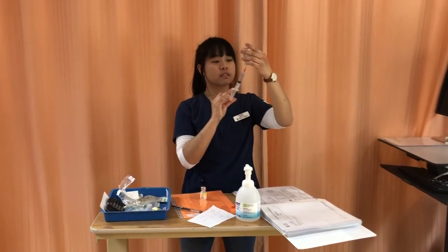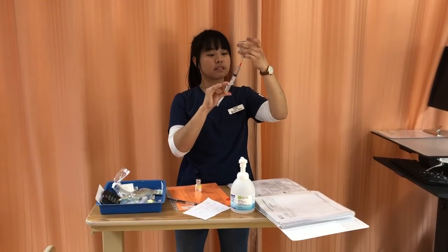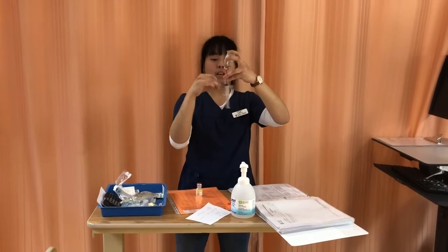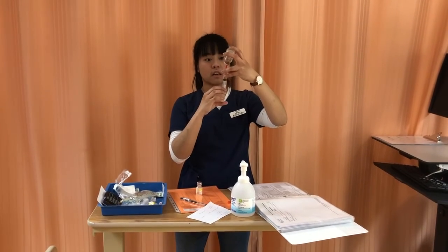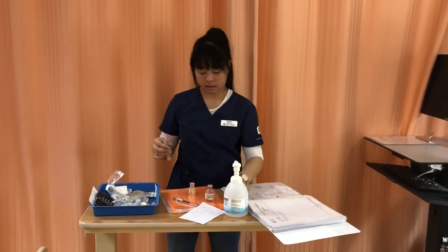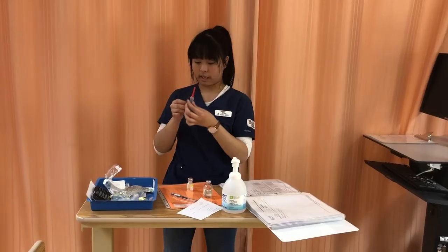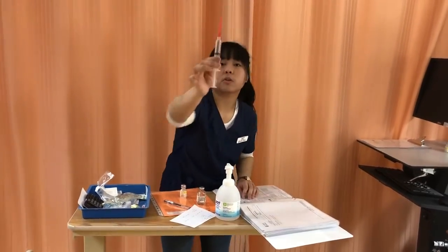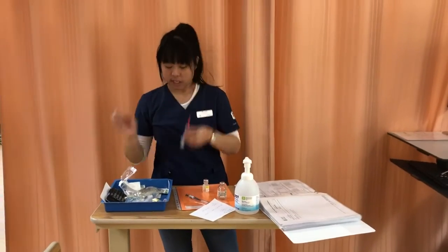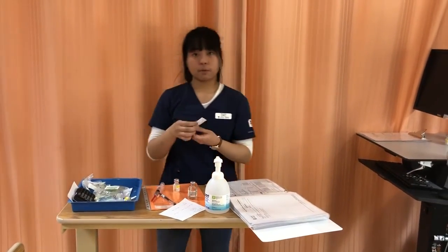And then that's all the medication I have for you right now, Miss Emma. And maybe you experience any of the side effects that I had mentioned earlier. Hold on. Take out my air bubbles, within 10 to 30 minutes. Recalibrate it to 6 mLs, like so. And just gonna do the scooping method as well. So like that. And I'm just gonna show you my 6 mLs, so we're good. And then I will just do my labels, which I already prepared for this purpose of the video.